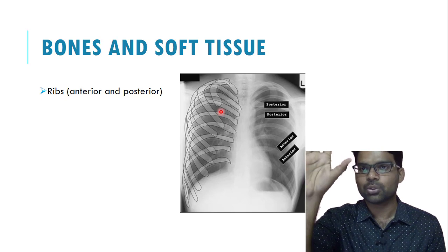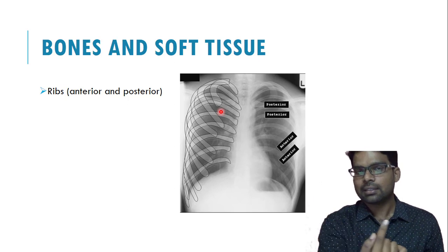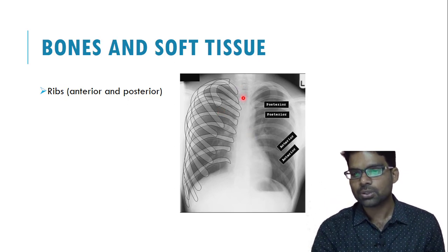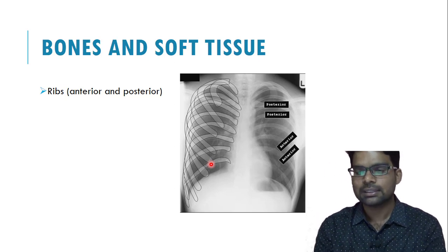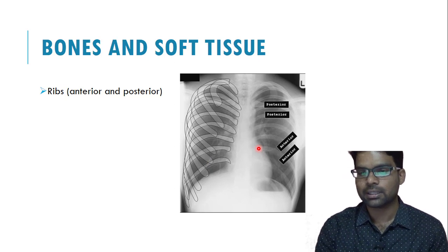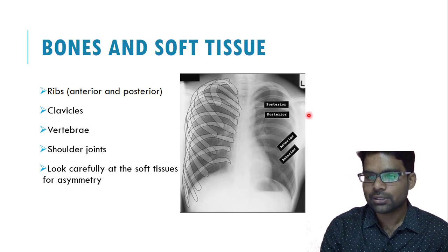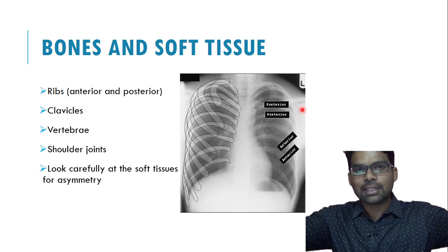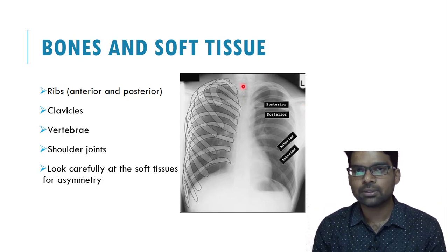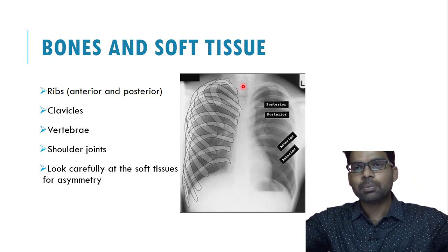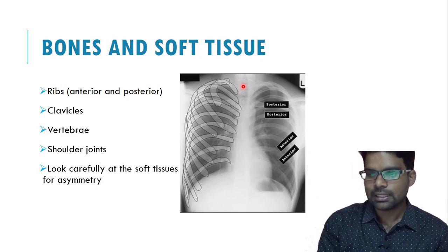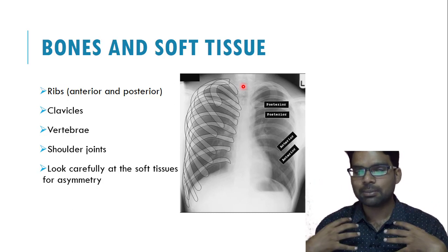Posterior ribs are clearly visible; anterior ribs are traced obliquely from anterior to posterior. Other things to look for: clavicles are almost horizontal in PA film and vertically placed in AP film; vertebral bodies and intervertebral disc spaces are barely visible in a normal chest X-ray; shoulder joints and acromioclavicular joints are high in AP film and at the level of the lung apex in PA film. Look for any asymmetry between right and left sides - any asymmetry is pathological.